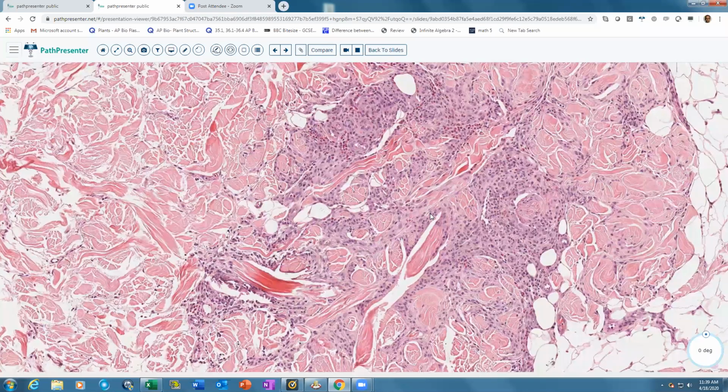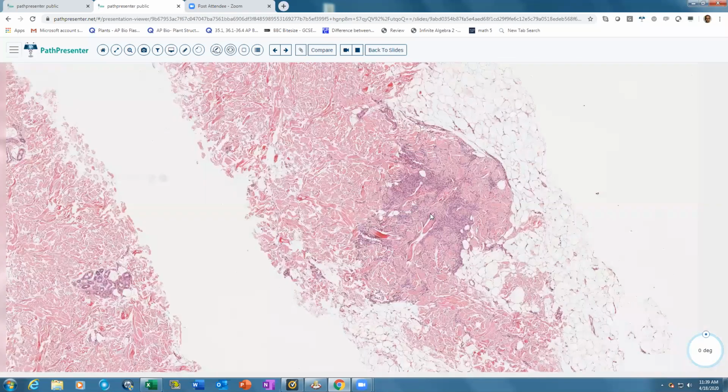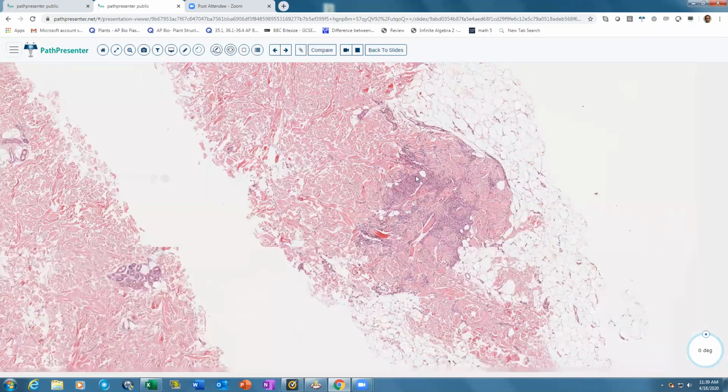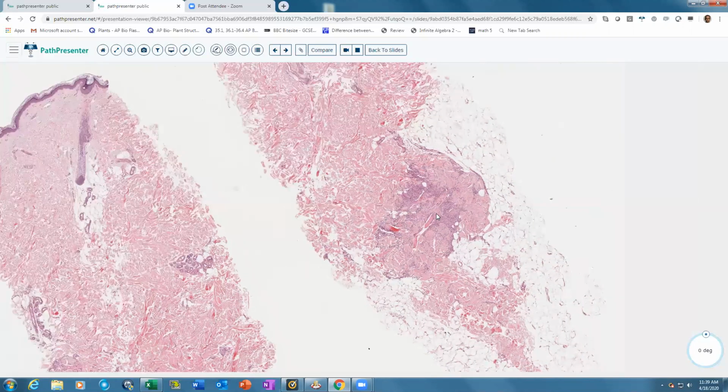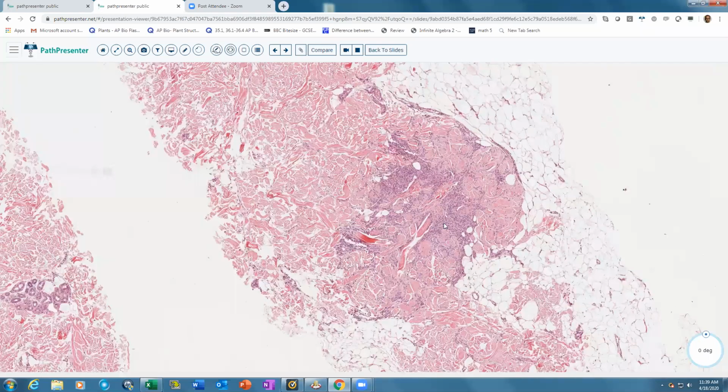Often you are going to see eosinophils, not a lot, but admixed within the infiltrate. Eosinophils are commonly seen in all variants of granuloma annulare. So if you see eosinophils, that also favors granuloma annulare. This variant of GA that is more common in young children is called deep granuloma annulare, where you see the palisade in the deeper part of the dermis, composed of macrophages, lymphocytes, and plus or minus eosinophils around necrobiotic collagen. Again, if you do the mucin, it's going to be increased within the palisade.